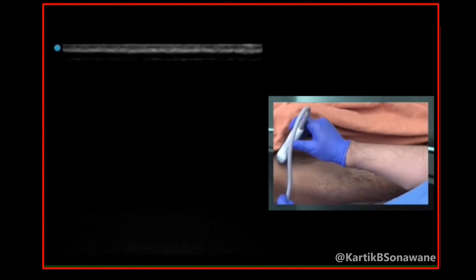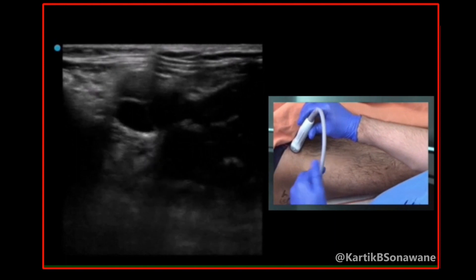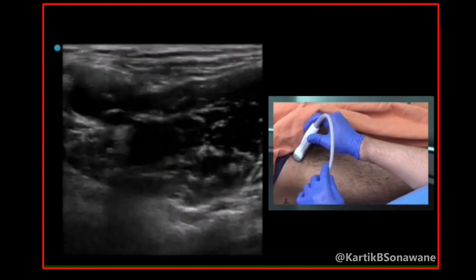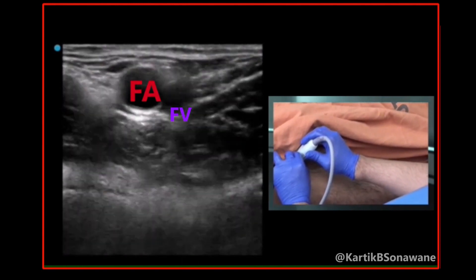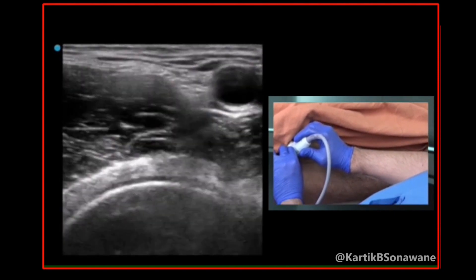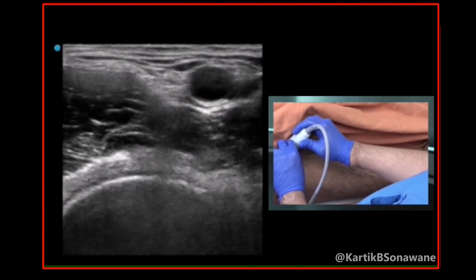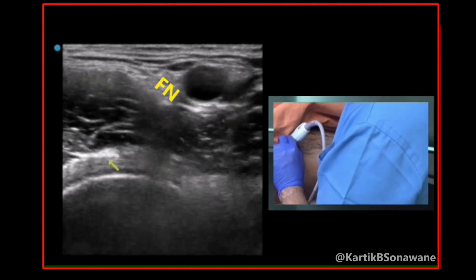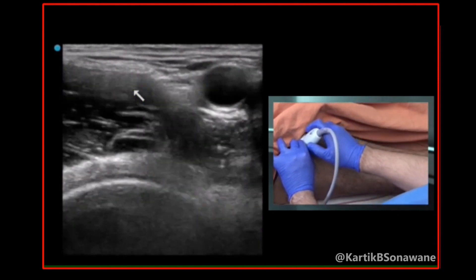After seeing the course of the femoral artery, we'll try to identify the muscles around it. Starting with the inguinal crease, my orientation marker is towards me and the leg is slightly externally rotated. Keeping the probe over the inguinal crease, I can see the compressibility of the femoral vein. The femoral artery is on the lateral side. You can see the hypoechoic iliacus muscle, which is quite a big muscle, and the femoral nerve gets sandwiched between the iliacus muscle and the femoral artery. You can see the hyperechoic femoral nerve at the level of the inguinal crease.